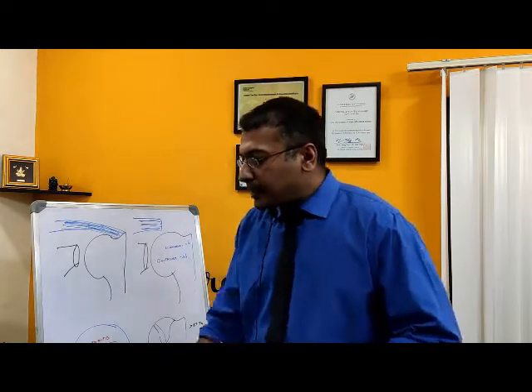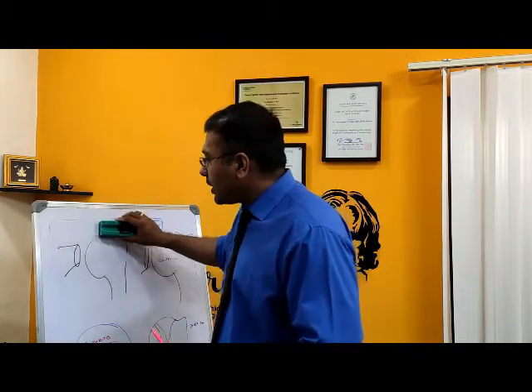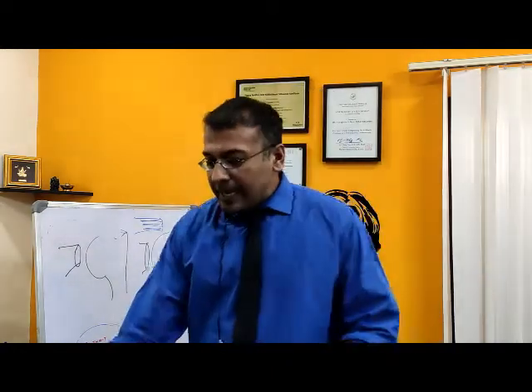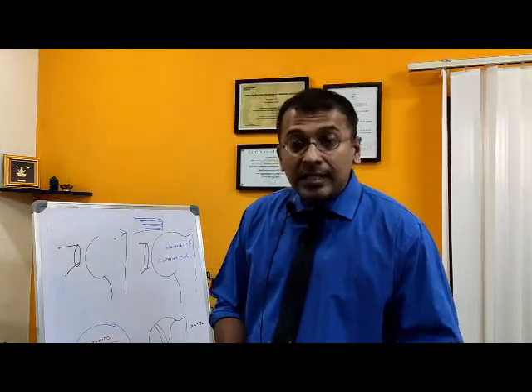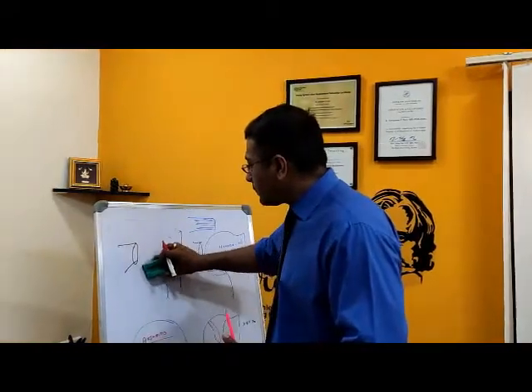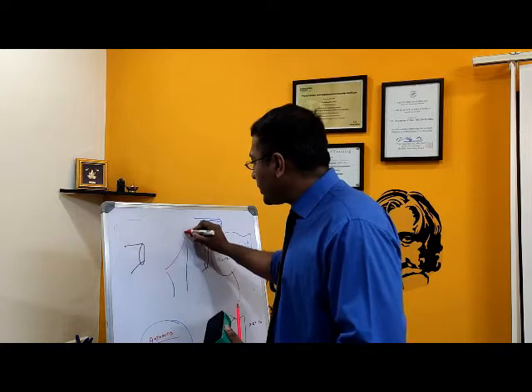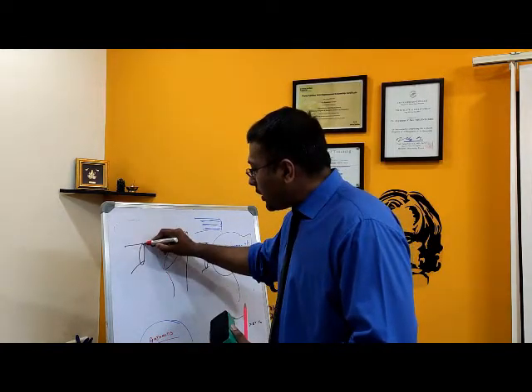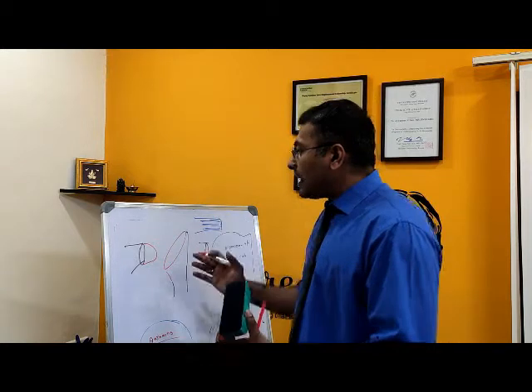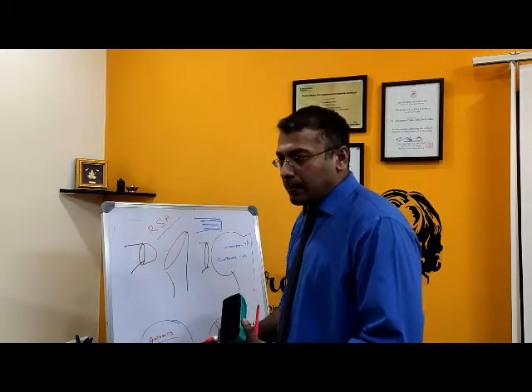Now, in certain conditions, we have to replace the shoulder. That means we have to remove certain injured or arthritic parts of the shoulder and replace them with steel or plastic. That is the shoulder replacement. In a reverse shoulder replacement, the positions of the ball and the socket are interchanged. The socket is like this now, and a new ball is put in this position. Because it is a reverse of the original or normal anatomy, it is called reverse shoulder arthroplasty or reverse shoulder replacement.